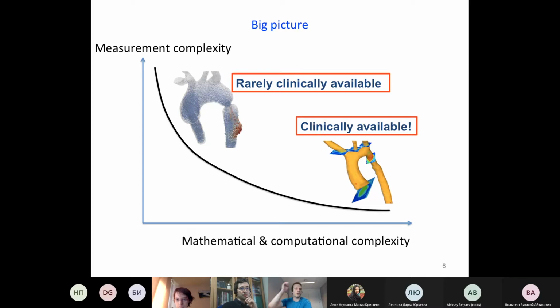Of course, there's a big research community, and they meet regularly in order to improve the acquisition and post-processing techniques for this type of data. And well, when you go to less data, for example, these 2D planes with flow information that is just perpendicular to the plane, that's the typical data that you can acquire everywhere.